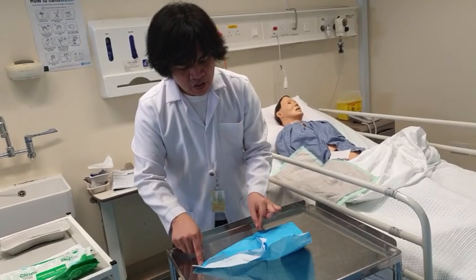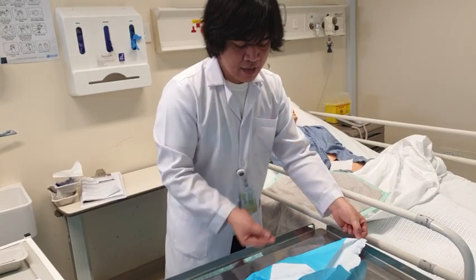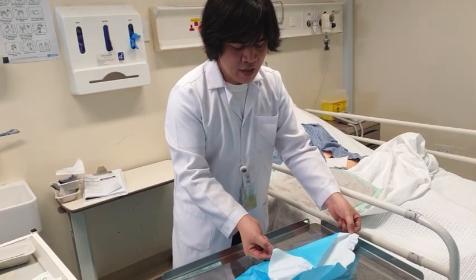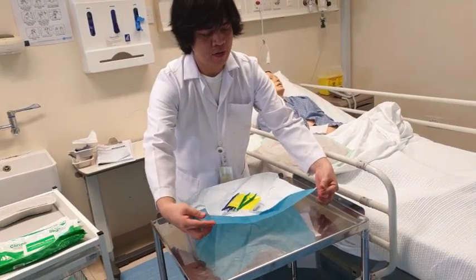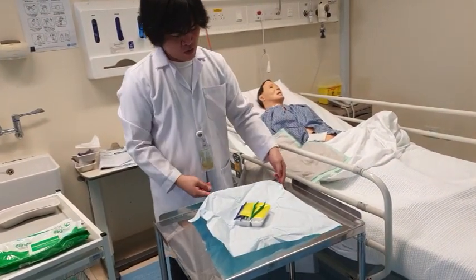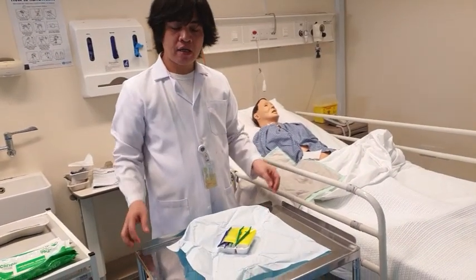And there's another flap here. Open it to that side. And finally, there is a flap here. Open it towards your side. So we are now uncovering the content of our dressing pack.